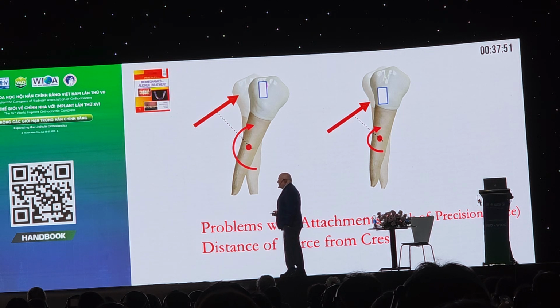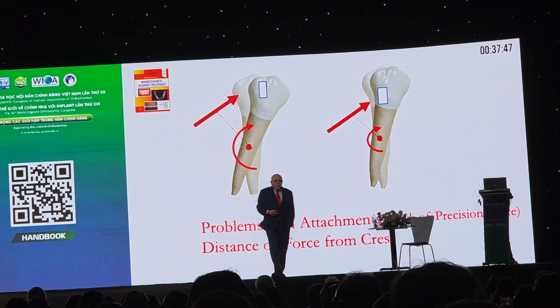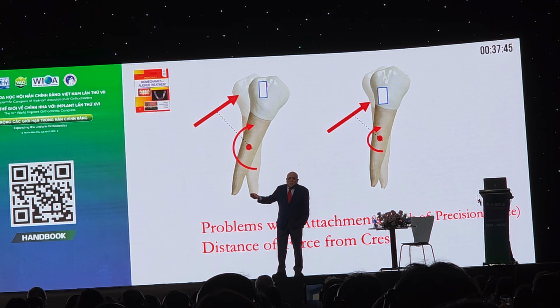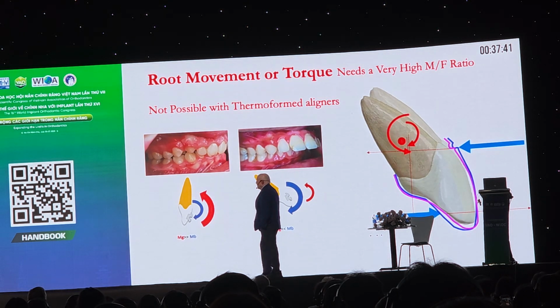Take a look at the distance. Where do you put attachments? It's going to be very different. So why don't teeth move properly? Because somebody else is doing it. You're not doing it yourself.